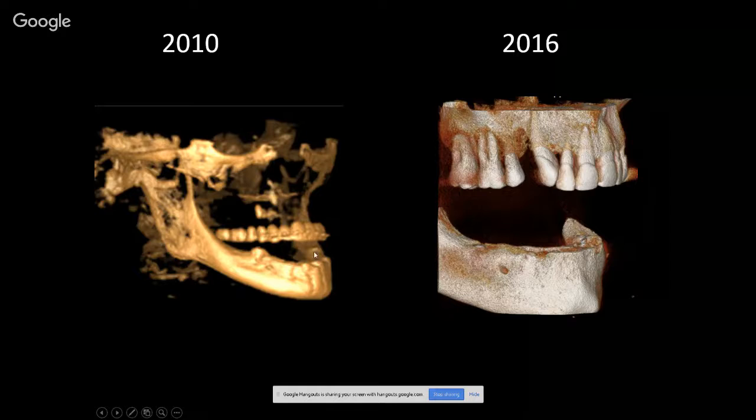And I want to point this out because the day of the surgery for this case, I didn't want to remove too much bone, but I was more focused on removing enough bone so that I could get her into a class 1 occlusion. This is a much more accurate approach using surgical guides and 3D printing on a Robox $1,500 printer, and better than anything that I could have done for this patient. I was extremely pleased.